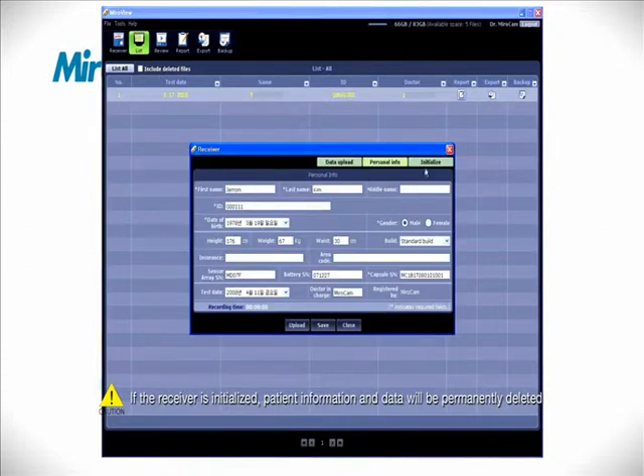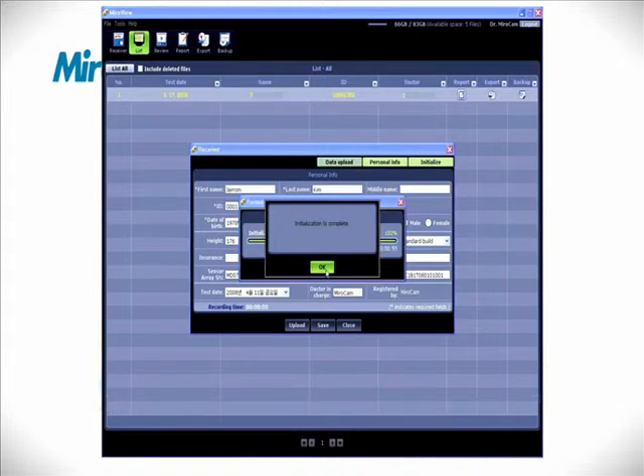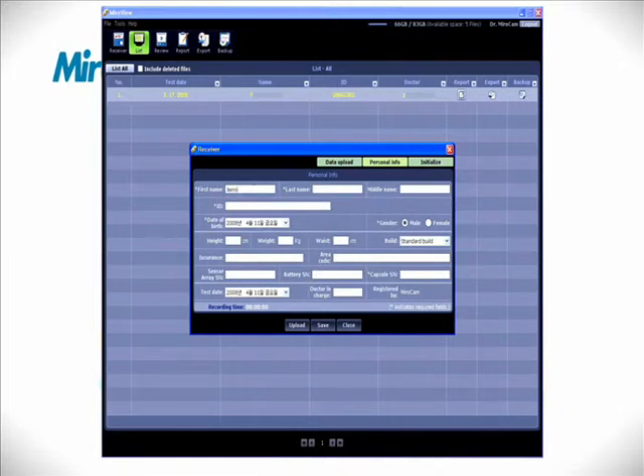After clicking the receiver button, click Initialize. After initialization, enter the patient data. Complete all required fields. If all required fields are not entered, the patient data cannot be saved.